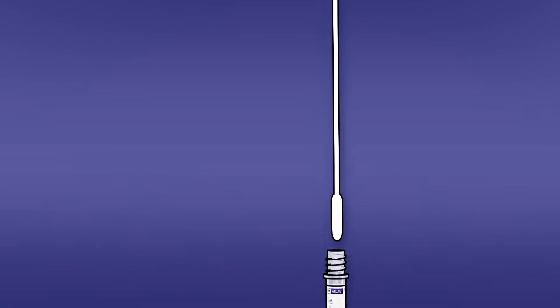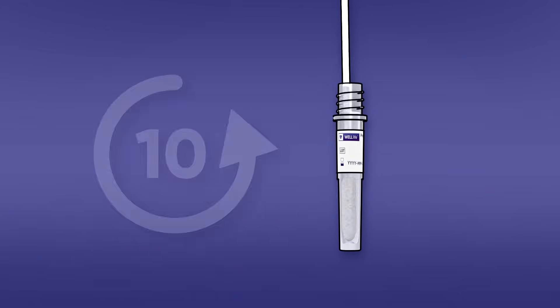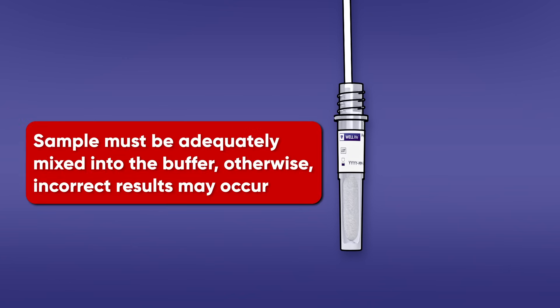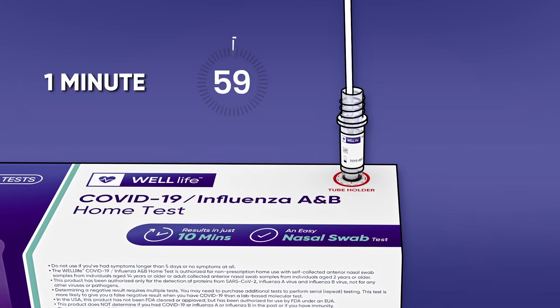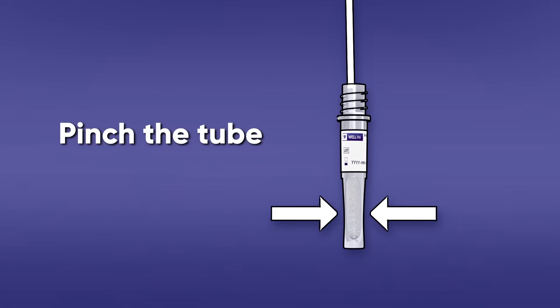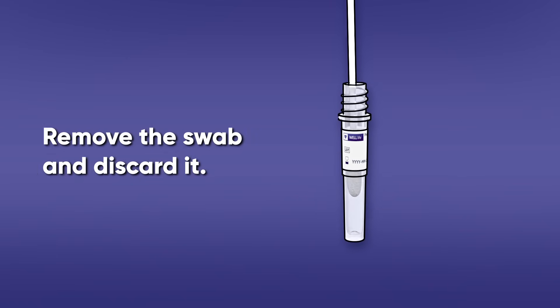Running the test: Immerse the swab into the buffer tube and swirl the swab in the buffer. Ensure the sample is mixed thoroughly by making at least 10 circles. The sample must be adequately mixed into the buffer, otherwise incorrect results may occur. Leave the swab in the buffer tube for one minute — a timer is recommended for this step. After one minute, pinch the tip of the swab from the outside of the tube to remove any excess liquid from the swab.